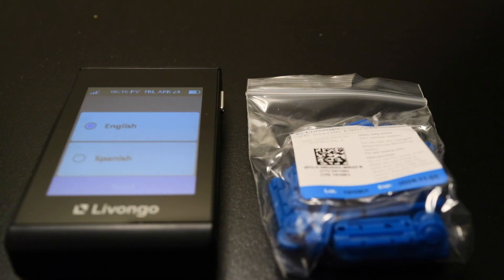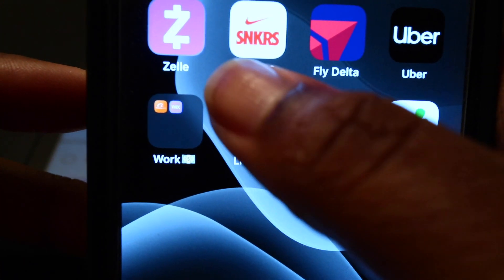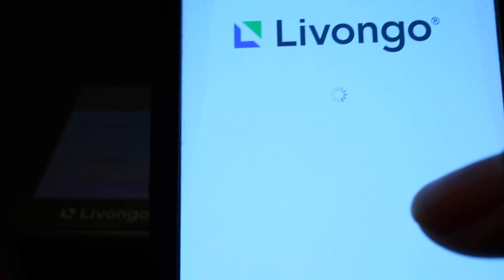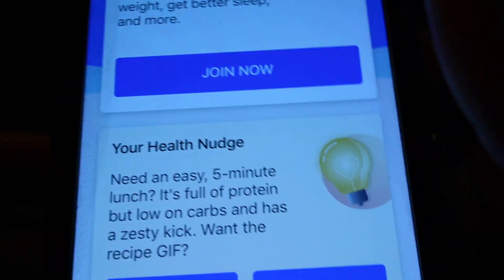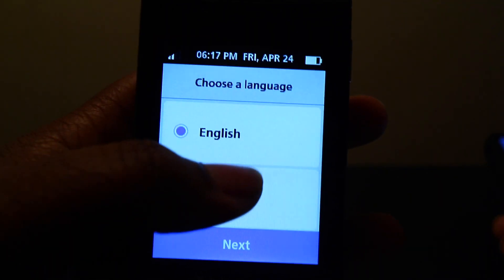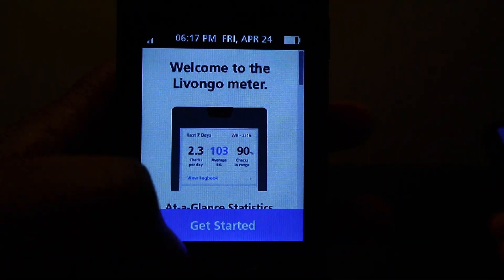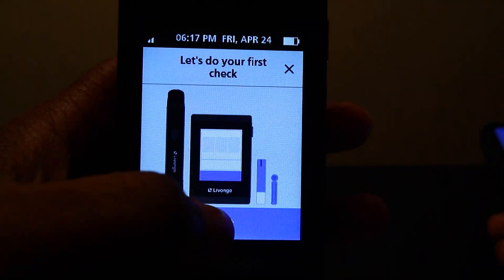Okay guys, I'm back. I am about to pull up the app — this is what it looks like. So you tap on that and it pops up. The meter is already on, so I'm going to hit English, then next. It asks: do you use insulin? Yes. Get started. Okay, I got to do my first check — I know it's going to be a little bit higher because I did just eat.